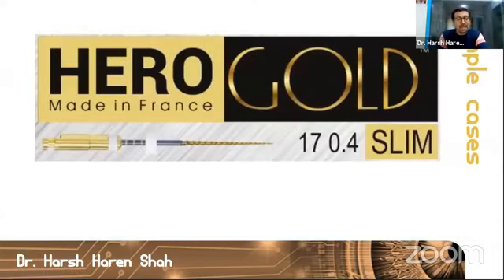One other glide path preparation file that is available for simple cases where your canals are already wide: you just prepare with your 10 number K file. You may or may not choose to go with a 15 number. You just prepare till 10 number probably. And then you could use a heat treated file with characteristics similar to a tip diameter of 0.17 millimeter, that is the 17 number file, and 4% taper. Choose a 3 or 4% taper rather than directly going for 6%.